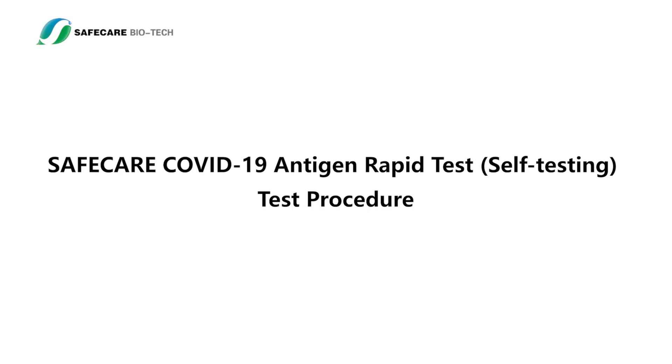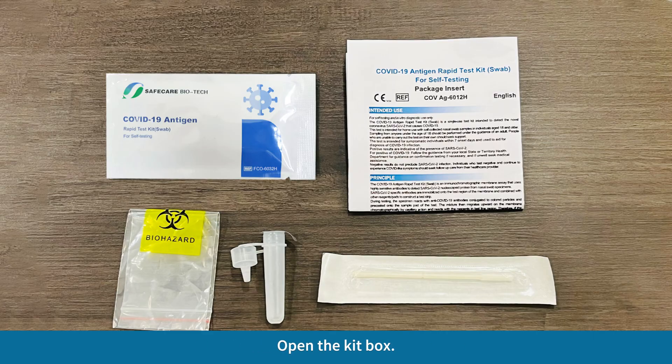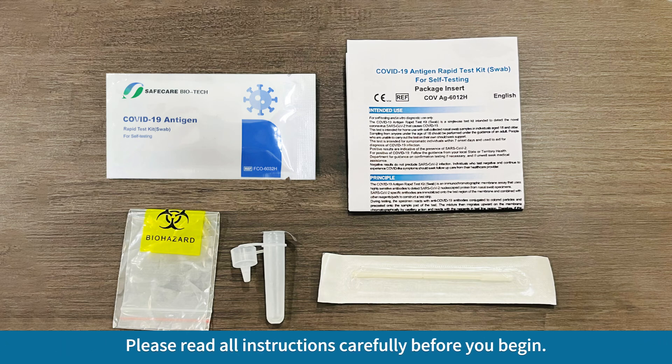SafeCare COVID-19 Antigen Rapid Test Self-Testing Test Procedure. Open the kit box and check the components before use. Please read all instructions carefully before you begin.